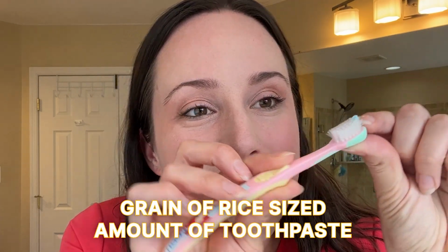I talk a lot about a grain of rice-sized amount of fluoride toothpaste. That's all you need up until a child turns 3. From the time that first tooth comes in, that's the AAPD official recommendation. So that is the 0 to 3 toothbrush.